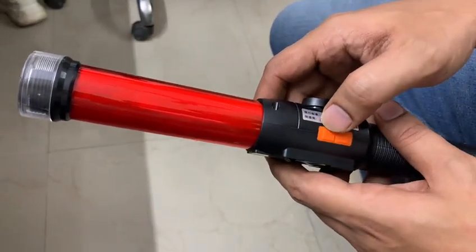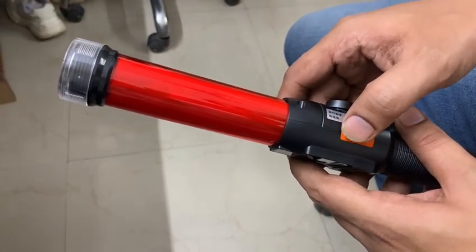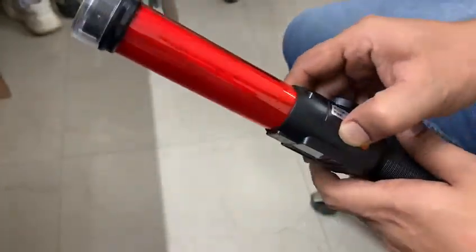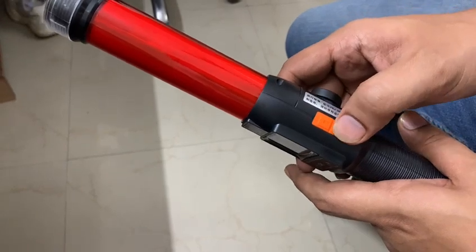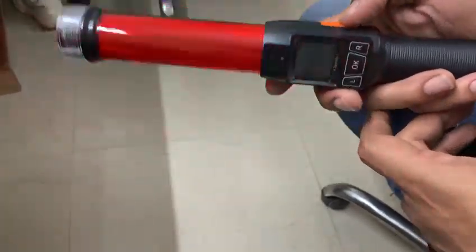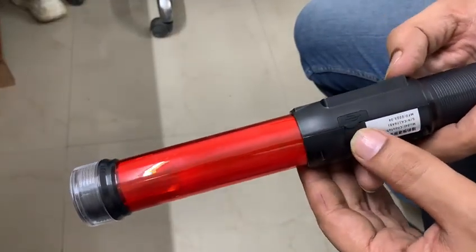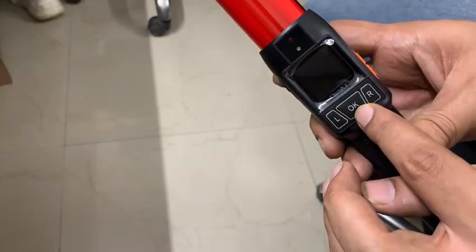When you press this button for a longer time, a beep will come. This is a flasher. This is a USB port for charging. This is an on/off button.